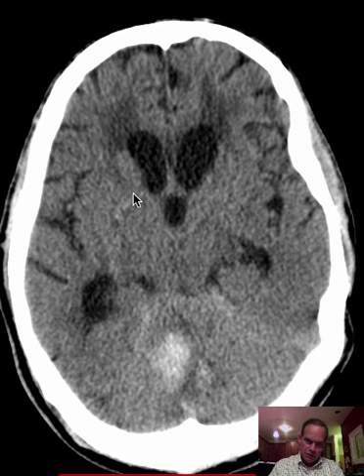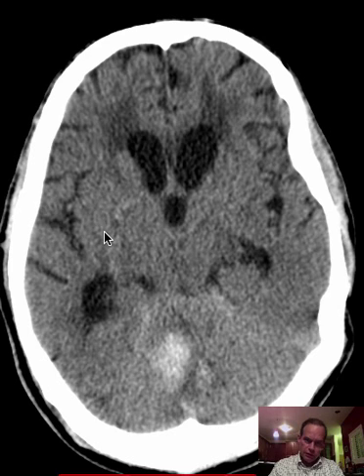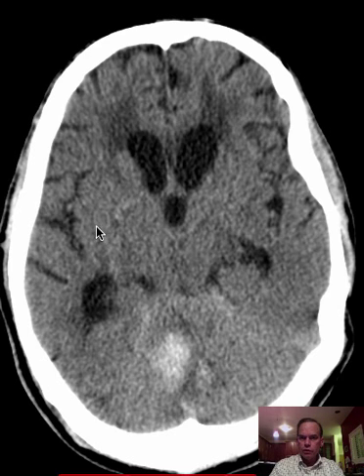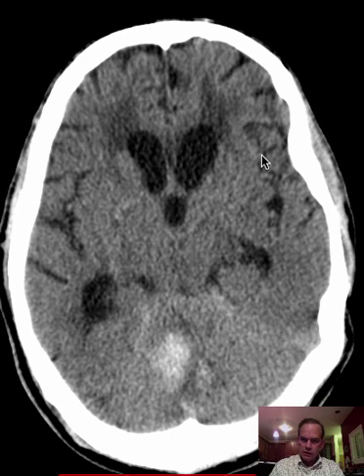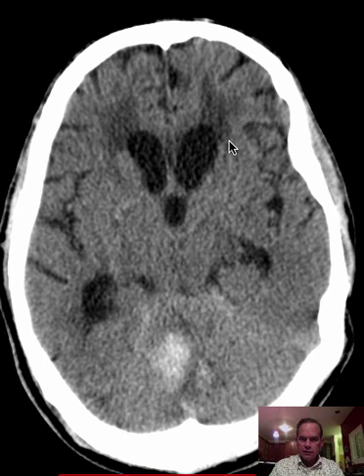The caudate, putamen — which is a triangular structure here with a convex border laterally — and globus pallidus are the threesome of the basal ganglia that we often refer to.